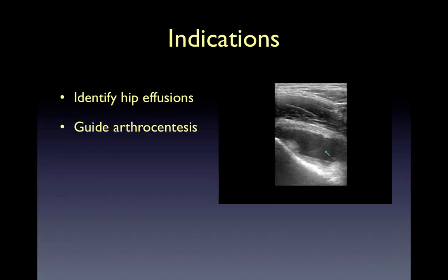What are the indications for hip sonography? This is easy. There are really only two. Identify a hip effusion in the setting of possible septic arthritis and provide real-time guidance for hip arthrocentesis.